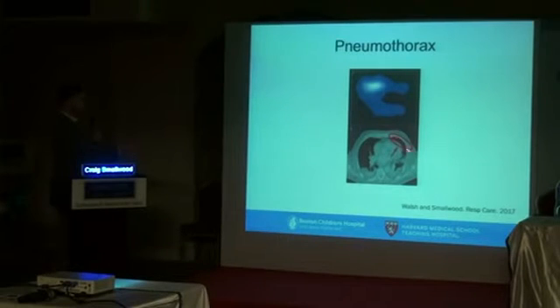So here you can see on the radiographic image, that is a pneumothorax, pretty obvious. No ventilation, and there's actually some literature to suggest that when you monitor continuously with EIT, or at least snapshots daily, you can detect pneumothoraces earlier than they would clinically manifest. I think that's one of the important keys. And what I love about this image too is simultaneously, no ventilation here, no ventilation here. Is this a pneumothorax? No, it's just alveolar collapse. But they're both black, and so those would both manifest on the EIT image similarly.